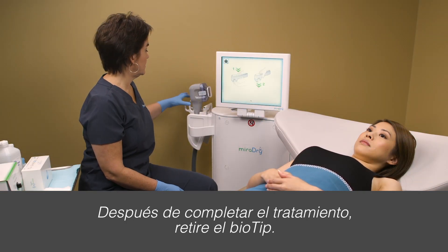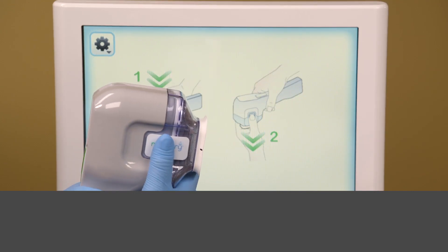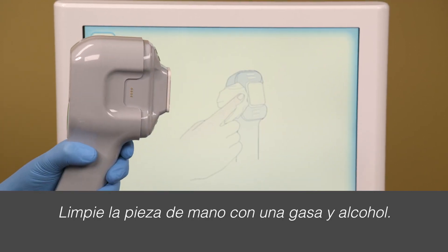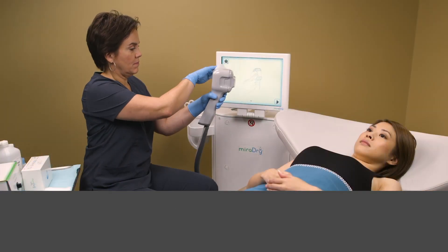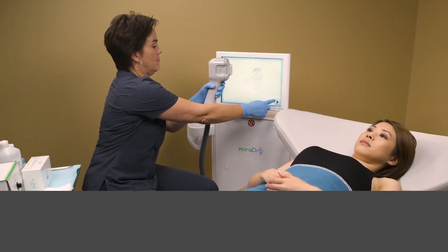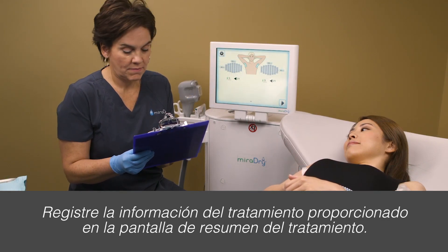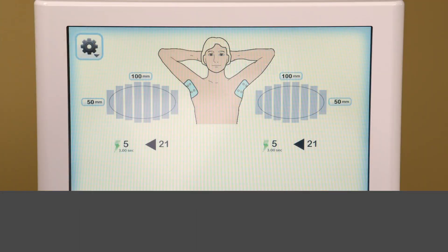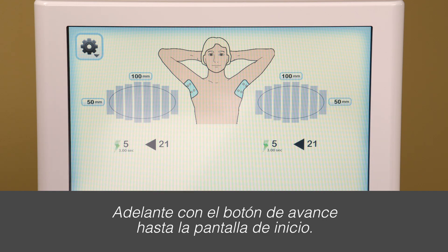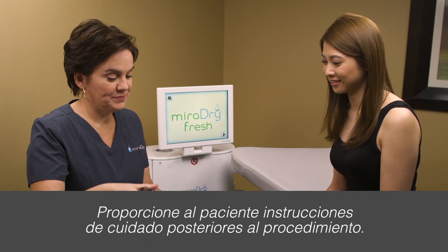After treatment is complete, remove the bio tip. Clean the handpiece with gauze and alcohol. Record treatment information provided on the treatment summary screen. Push the forward button to return to the home screen. Provide the patient with post-procedure instructions.